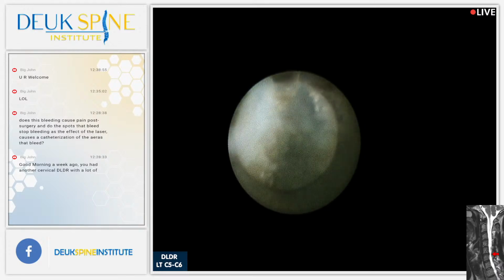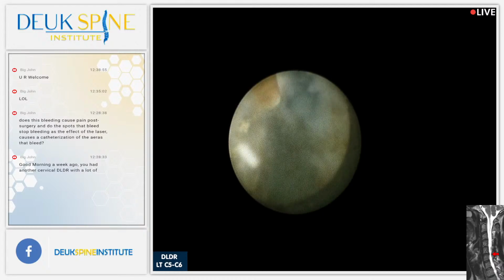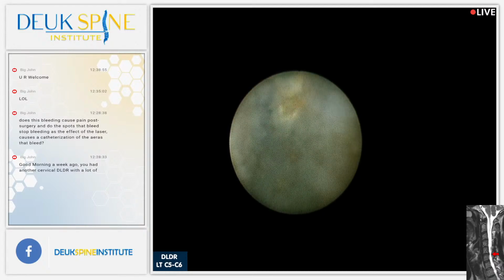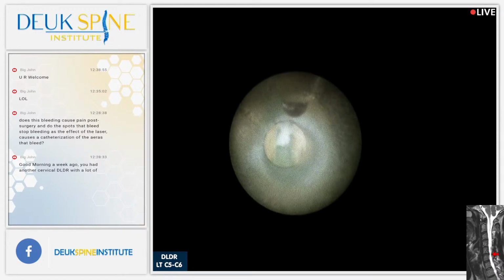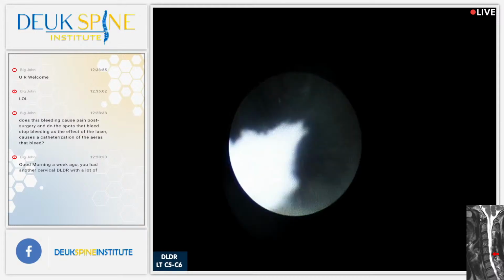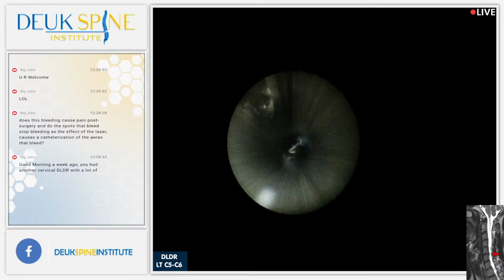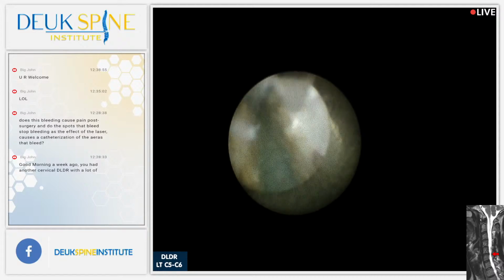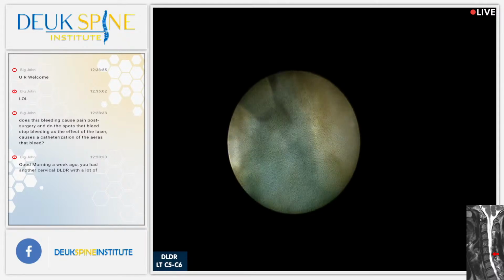And we're just cleaning everything out here, and I got about 2 more minutes and we should be done. But there's the herniation there, another one sitting in the foramen, right, Luis? And well, you can see from watching this lots of pieces of herniation just flittering up. Every one of those is another herniation, folks. I'm not making those herniations. They're already made. They're already there.